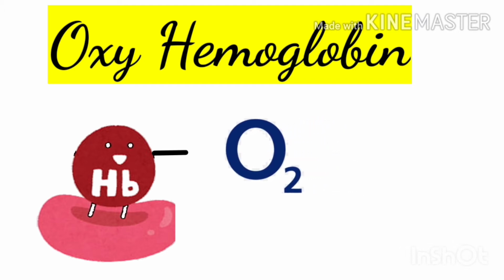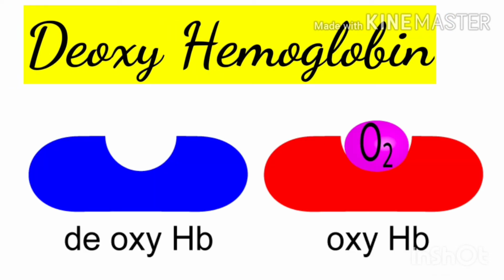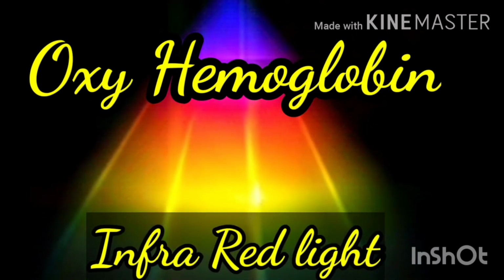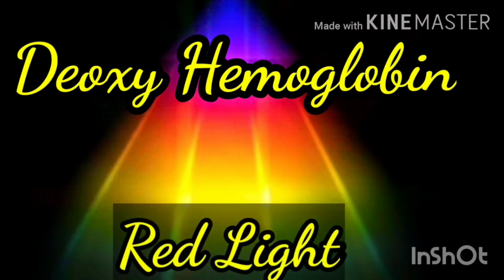This oxyhemoglobin generally absorbs the infrared light. And next comes the deoxyhemoglobin. The hemoglobin which does not carry oxygen is known as deoxyhemoglobin. Oxyhemoglobin absorbs the infrared light, whereas deoxyhemoglobin absorbs the red light.